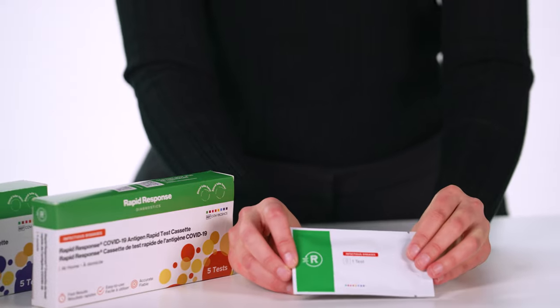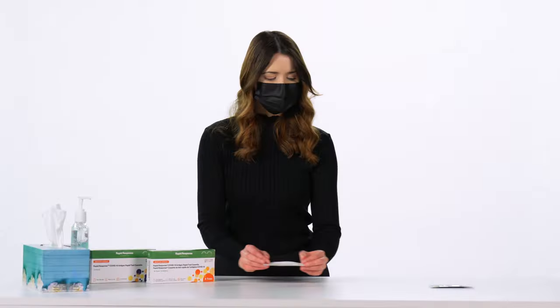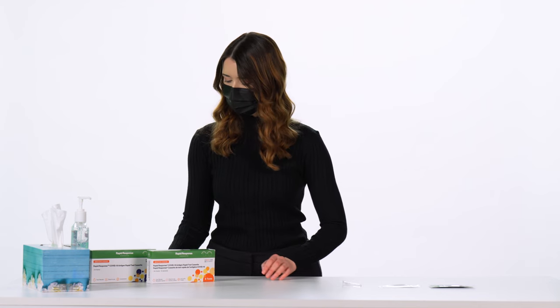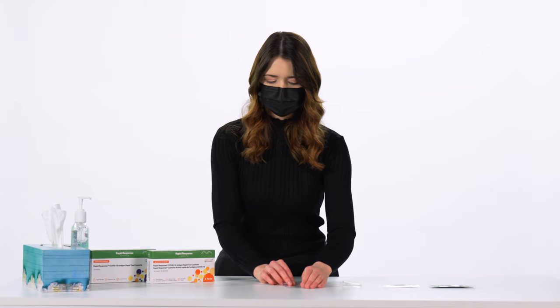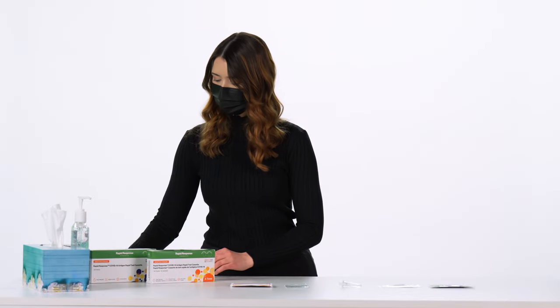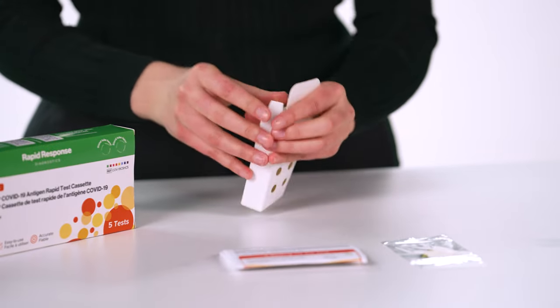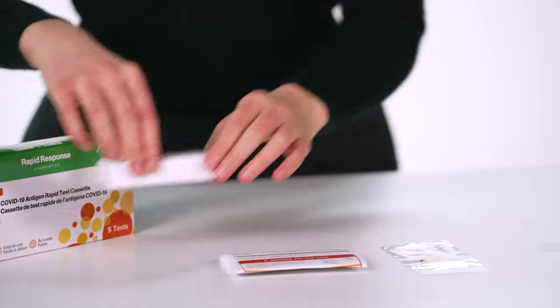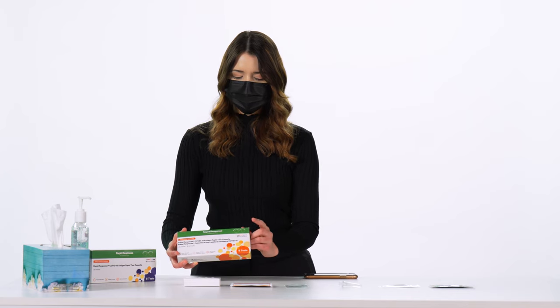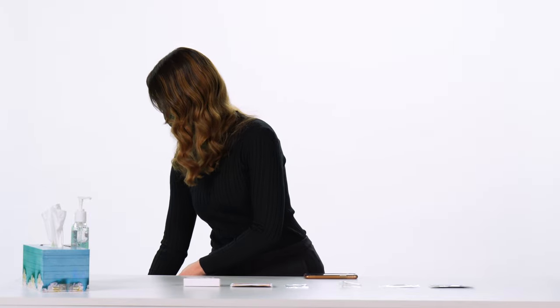For each test you will need a test cassette, a swab, an extraction buffer tube, a waste bag, the instructions for use, and the kit box. Make sure all the kit components are intact. You will also need a clock, timer, or stopwatch to complete the test.